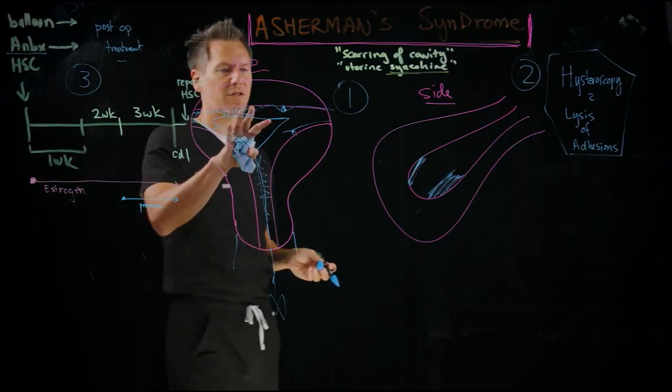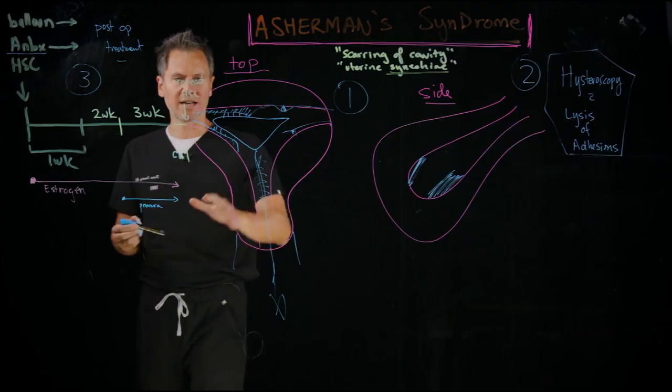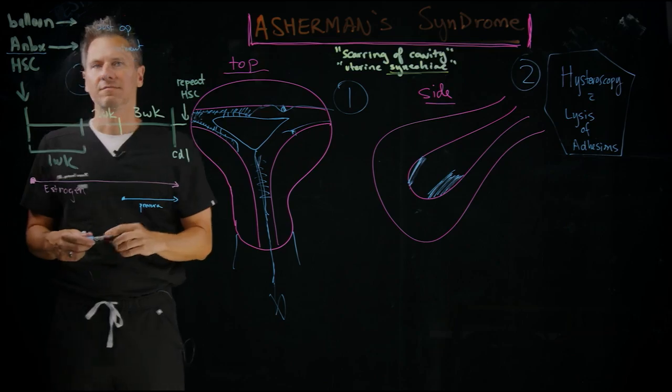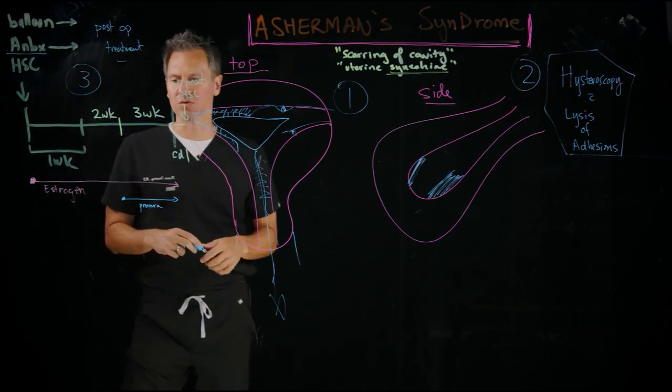Now, there's some debate of whether this makes a difference or not, but somewhat ideologic. Some people like to keep this in. It makes everybody feel better, like we're doing something. I don't think it's unreasonable to have the balloon, and it's largely used.